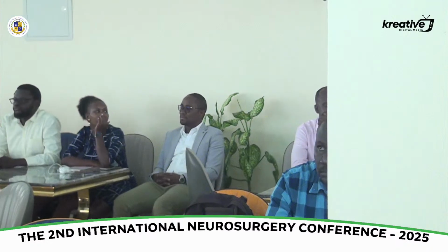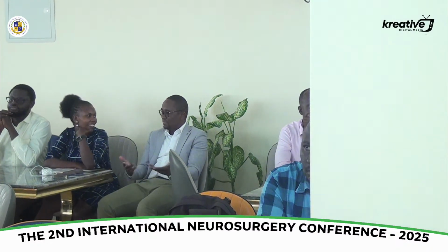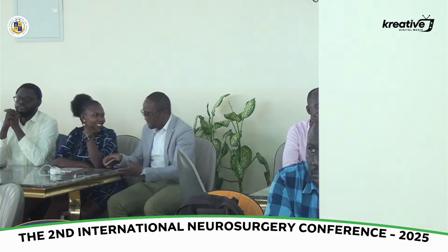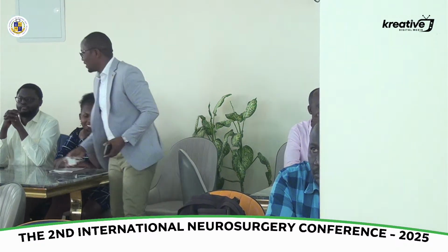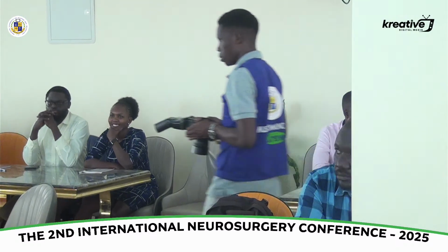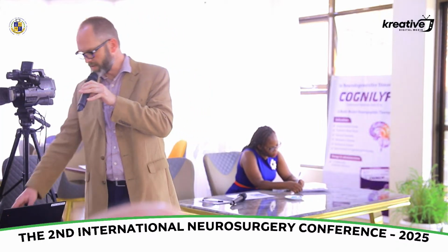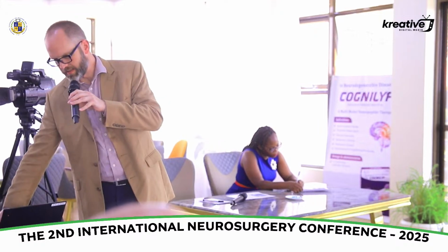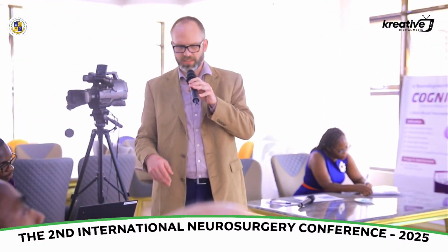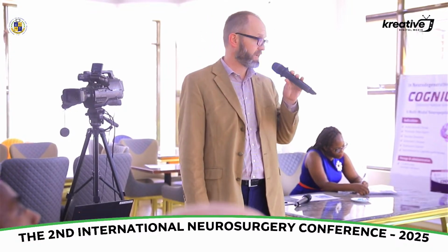Basic types of ultrasound, if we want to go a little more into detail now. A-mode is often used in ophthalmology, and this gives you just one dimension. It's not used often in neurosurgery, so between two different tissue densities. It's often used in the orbit to understand measurements that are normal or abnormal depending on various technologies in the eye.